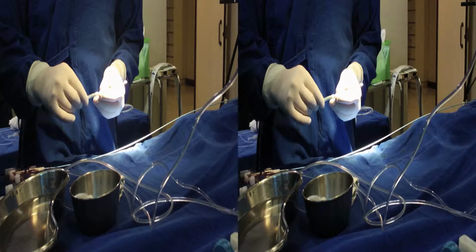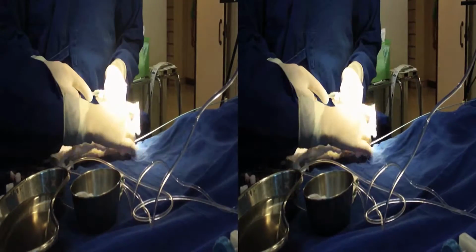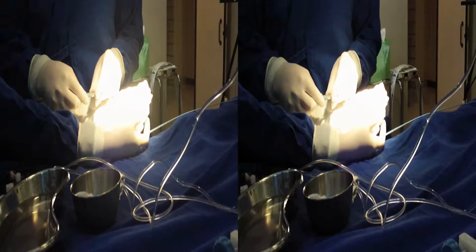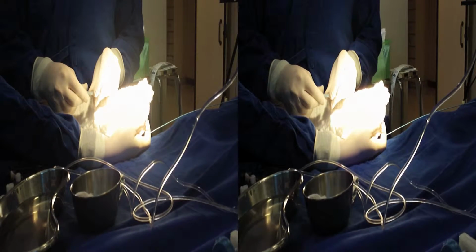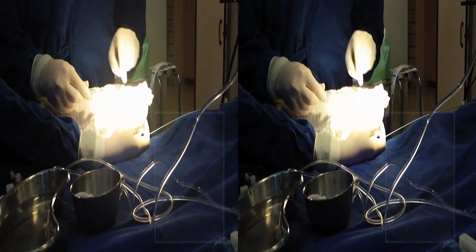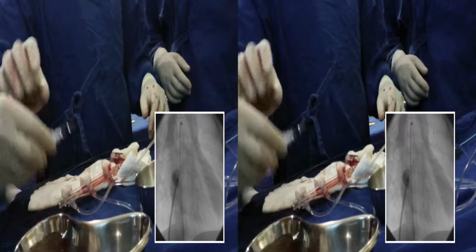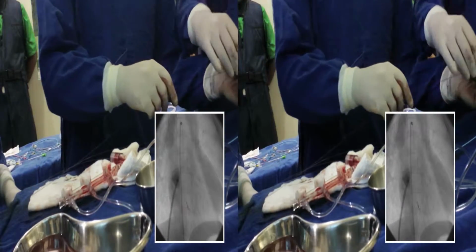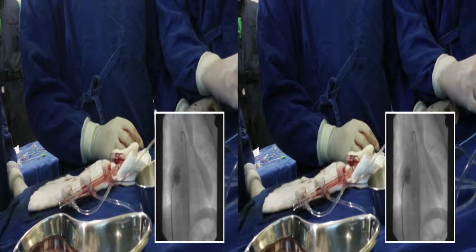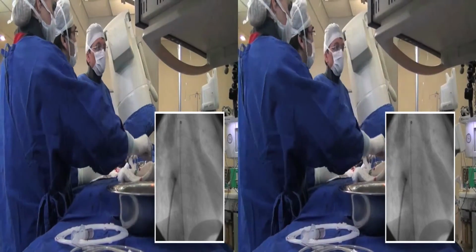We measured the diameter, 4.3 millimeters, and length, 6 millimeters, and chose an Amplatzer plug 6. For measurement purposes, we conducted multiple injections of contrast that can be seen in different projections.